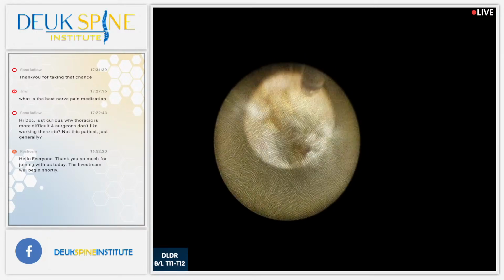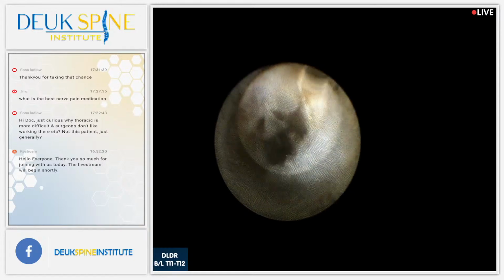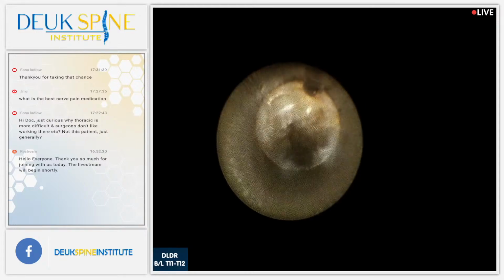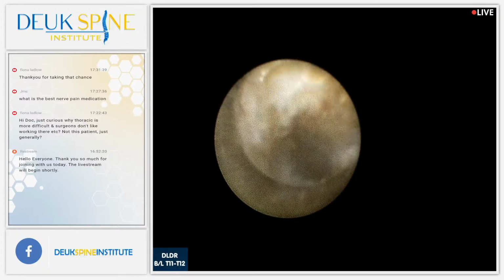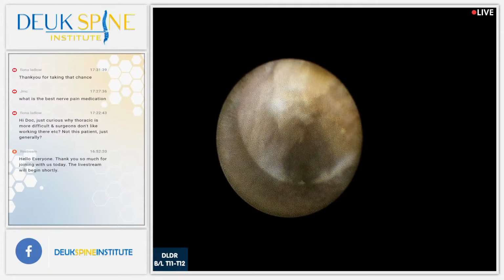All right, so you can see already we've debulked quite a bit of this herniation. And we're almost done as much as I can do. Remember, I can't get it all. And I tell people that. I can't get it all. So don't be disappointed if I didn't get it all. But let's see. Maybe we can get enough of it to make you feel a lot better. And that's really what we're trying to do.